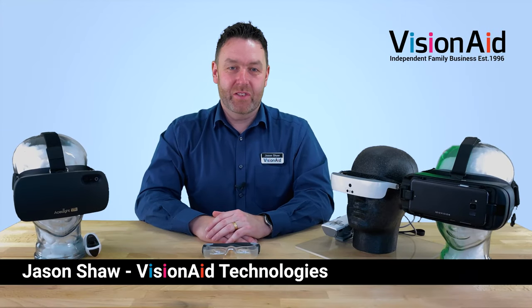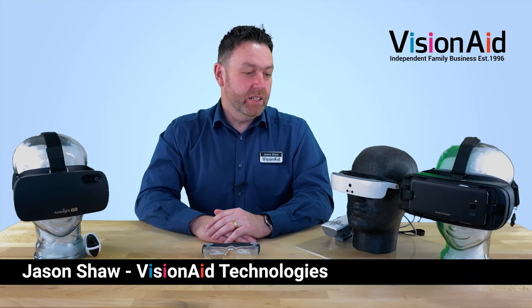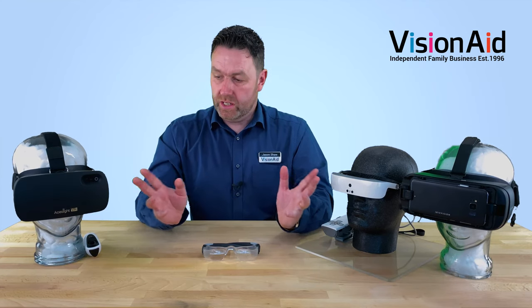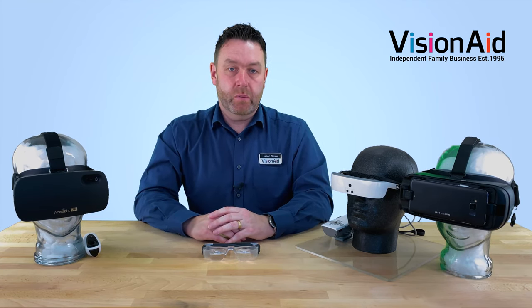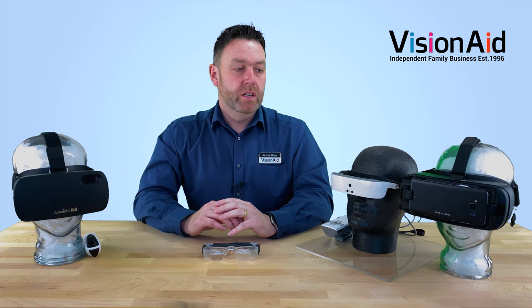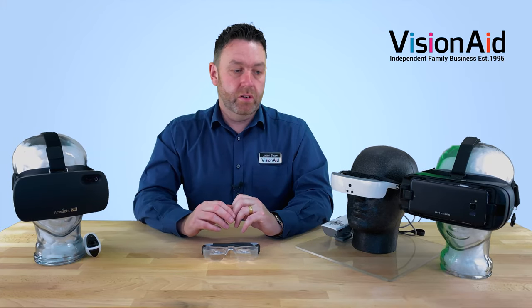Hello everyone and welcome to another VisionAid video. Today we're looking at wearable technology, so we've got just a small selection of some of the wearable headsets that we have here. We're particularly looking at the magnification side of these devices because some of them have a few more features than others.